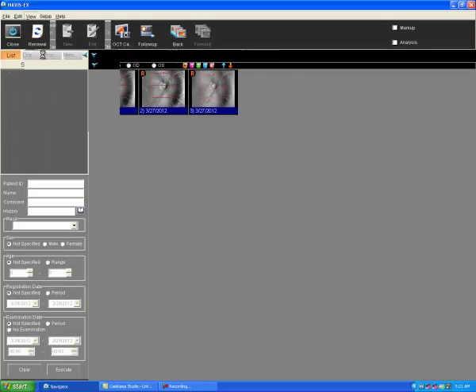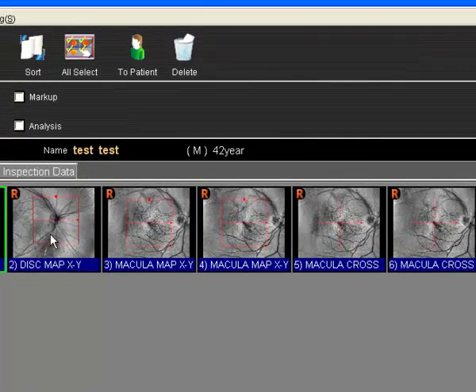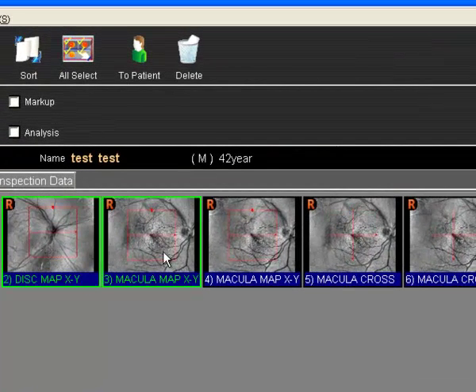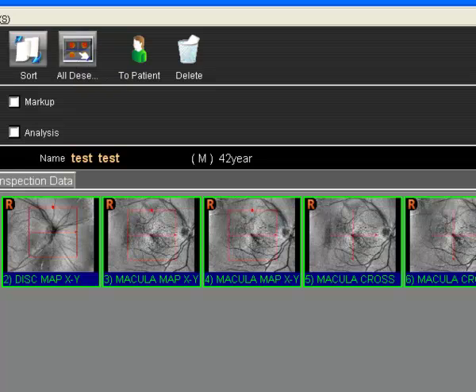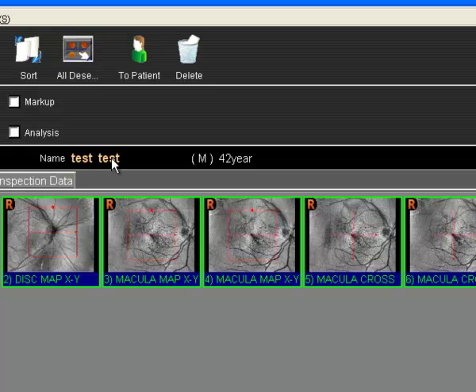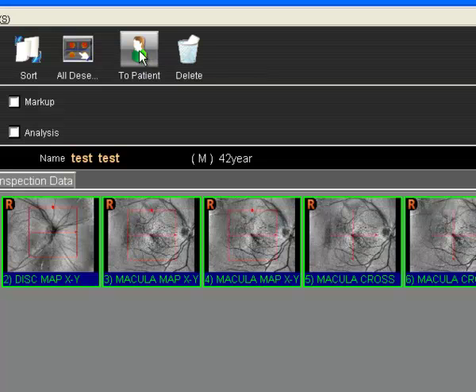I select recycle and the tests that I have just deleted are all here within the recycle manager. What I'll do now is select those tests either individually or by hitting all select. You'll notice that the patient I had highlighted previously, test test, is now selected. Test test is the patient we want to send it to, so I'll hit send to patient.